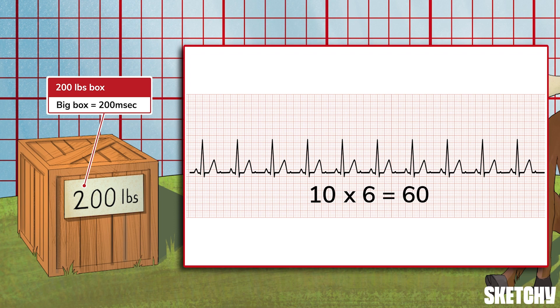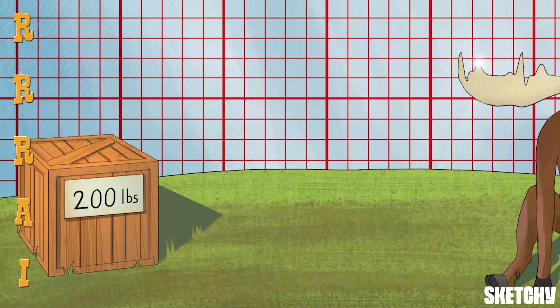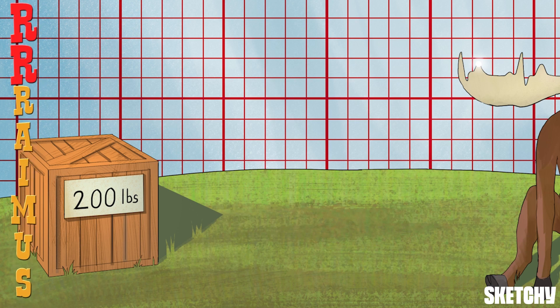To prevent awkward silences interrupted only by the impatient sighing of the resident, feel free to say all of this out loud — people love hearing your thought process. But why is this step 'Rate Rate' instead of just one Rate? Because although the atria and ventricles are usually in sync, it's important to catch when they aren't. For example, in atrial flutter the atria may be going at 300 but the ventricles are at 150 — so quickly do the same counting tricks for the P waves.